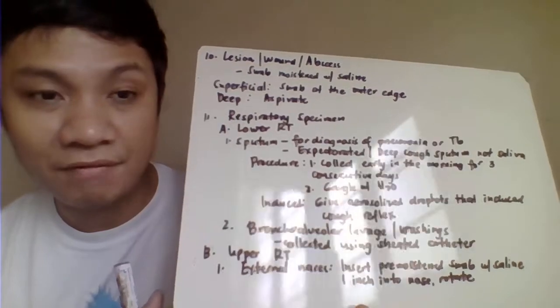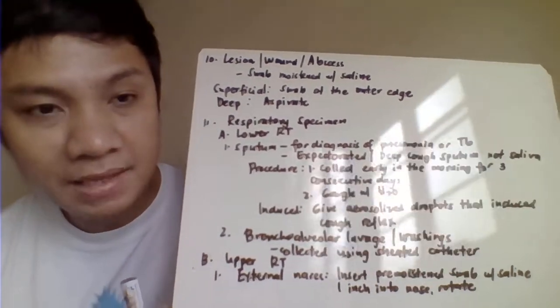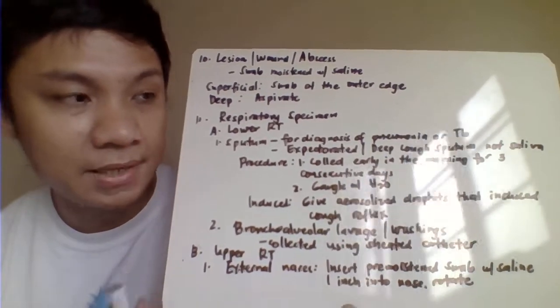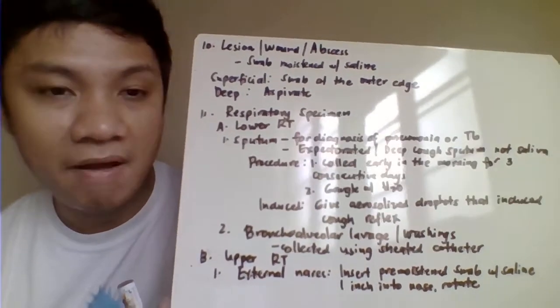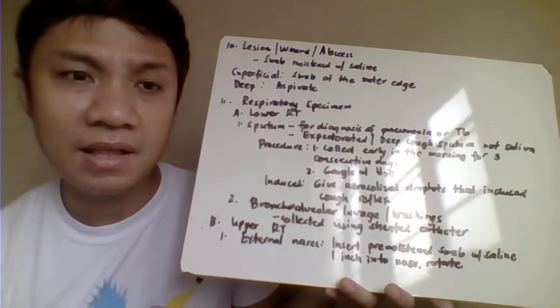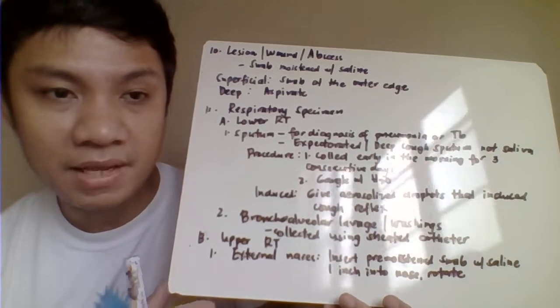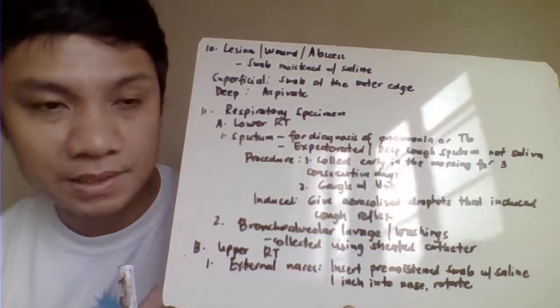The patient should not have taken a meal. Approximately for the diagnosis of your Mycobacterium tuberculosis, there are 3 specimens collected every day for 3 consecutive days. But I think ngayon, sa interim guideline ng Department of Health, 2 specimens are already enough for the diagnosis of your Mycobacterium tuberculosis.